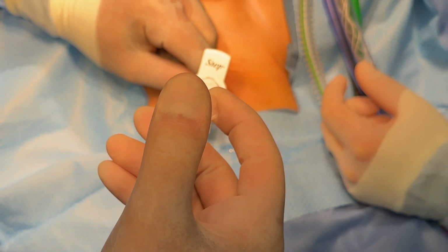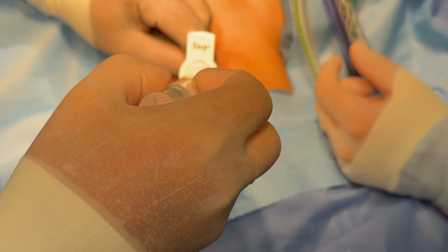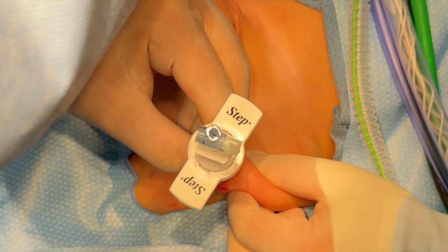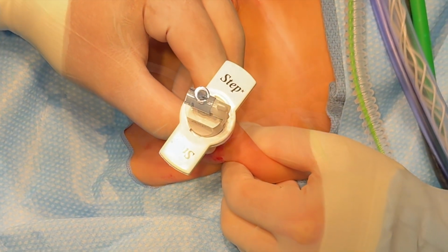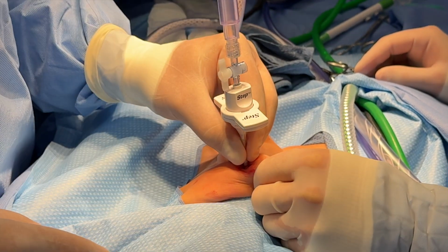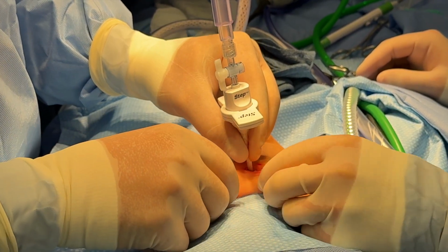5 cc of saline is then instilled. If there is no resistance, the syringe is then aspirated to ensure that no saline returns, indicating that the needle is not in a closed cavity. The syringe is then removed. A drop test is then observed to confirm that the remaining fluid has traveled down the needle. Insufflation is then started while monitoring that there are not high pressures with low volumes.